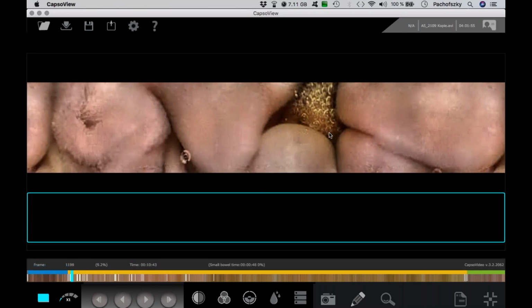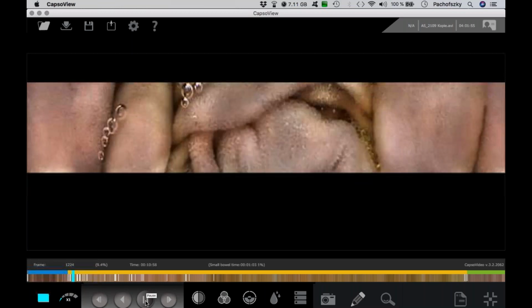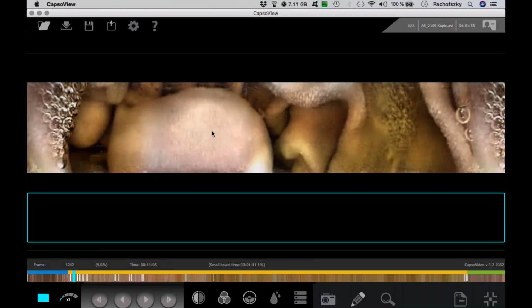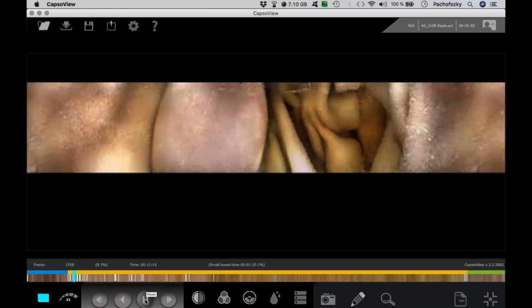Here is another one in this area. You can see it because there's a difference in the surface because of the volume under the mucosa. The mucosa is flattened, and you can see how it's looking. And we go on, and I won't stop now for all the lesions because you can see here again a lot of submucosal masses. I can tell you all of them are lipomas.